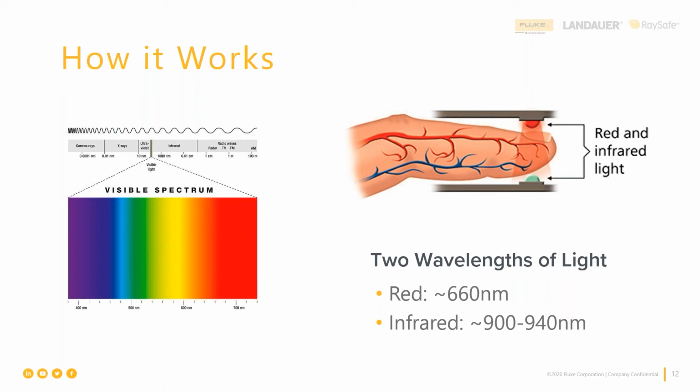for that patient. But there's one more important requirement in pulse oximetry. The blood has to be pulsatile. There has to be a pulse that is able to be sensed. If there's no pulse, the assumption is it's just from a vein and not from an artery. So it means an improper positioning typically of the sensor.